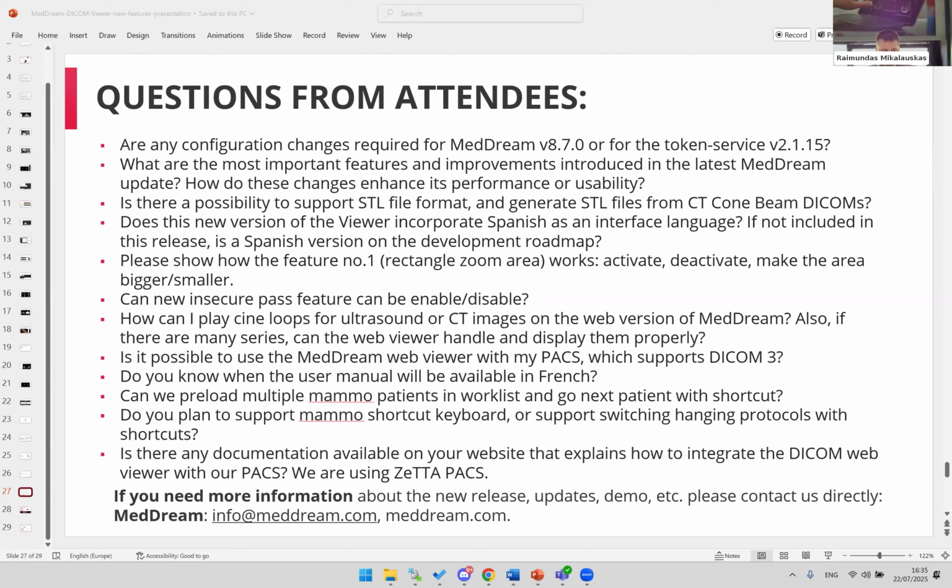And adding to Renata, tomorrow we will publish 8.7 to everyone and put all the documentation and update the page.